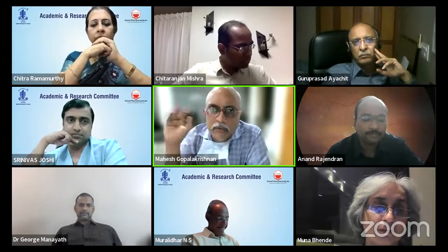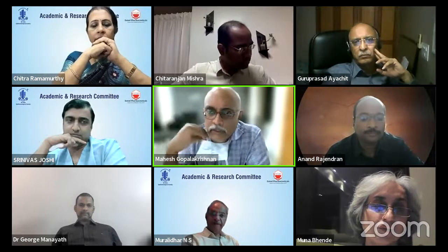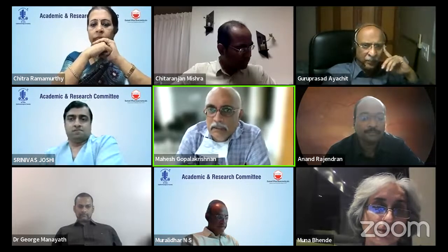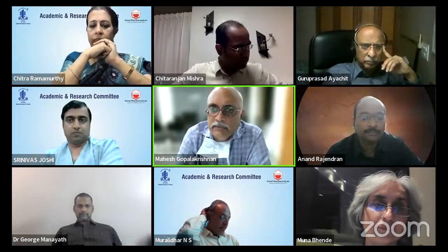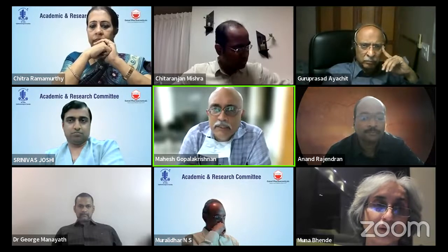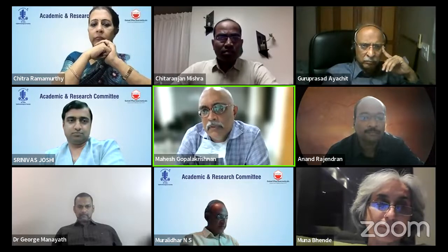So I try to do ICG in all cases initially, and if you want to see the response to treatment with thermal laser or PDT, I repeat ICG after 3 months. But in this anti-VEGF era, now we don't have PDT. So only if I suspect a peripapillary or extrafoveal polyp, I am doing ICG regularly.